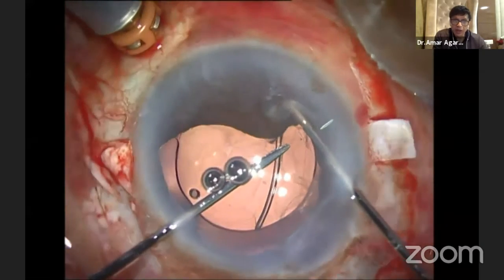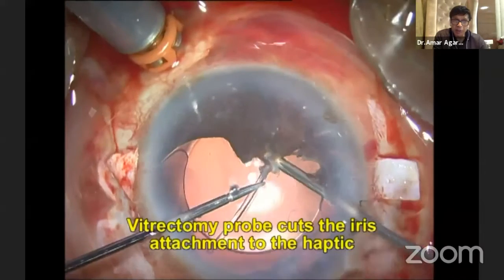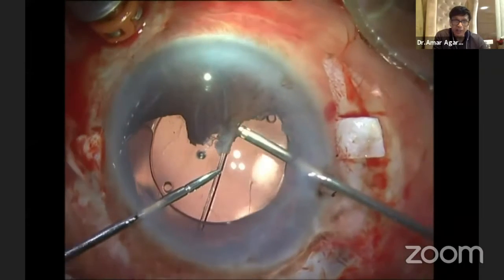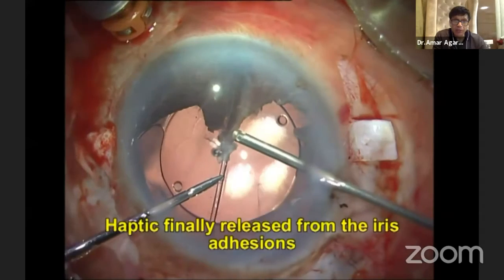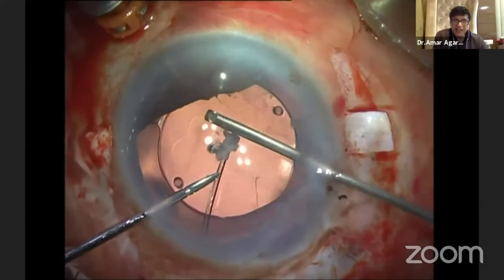I have no other choice but to use a vitrectomy probe. So I'm taking my vitrectomy probe, and with that I'm chewing up that iris. I know it's butchery, but I can't help it at this stage. You can see I'm chewing up the iris as much as possible so that that area gets removed.